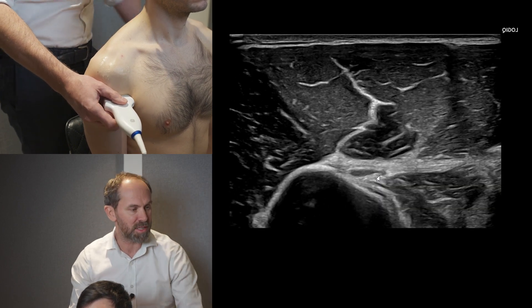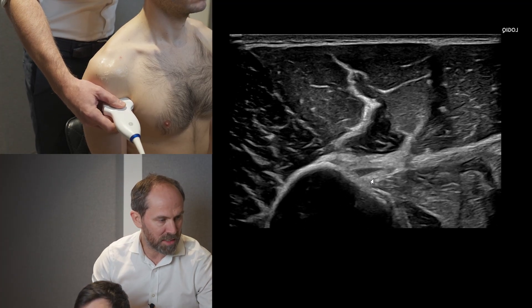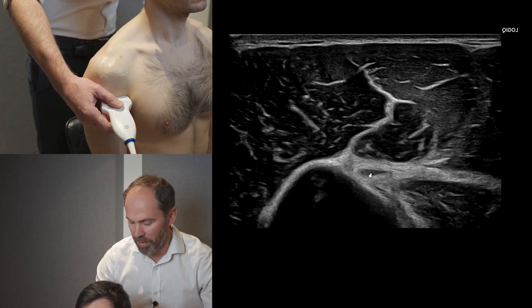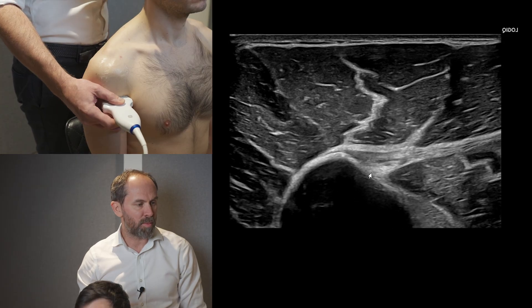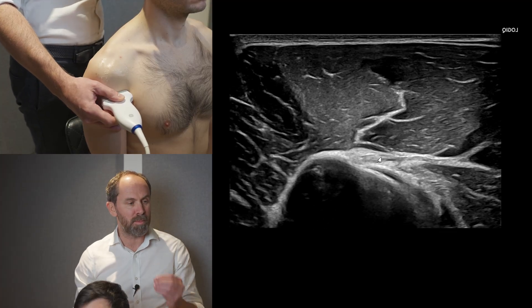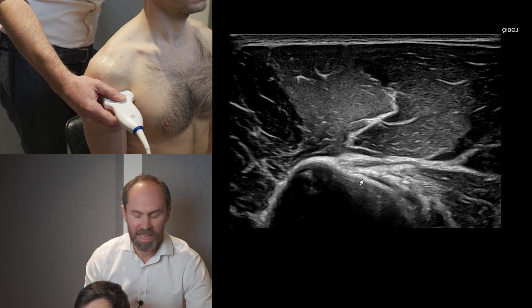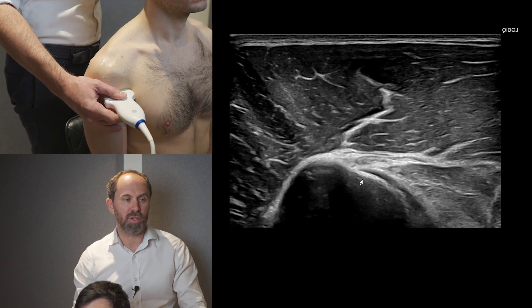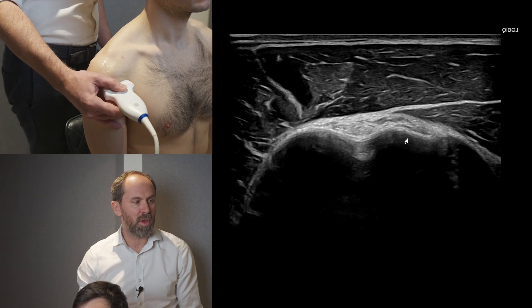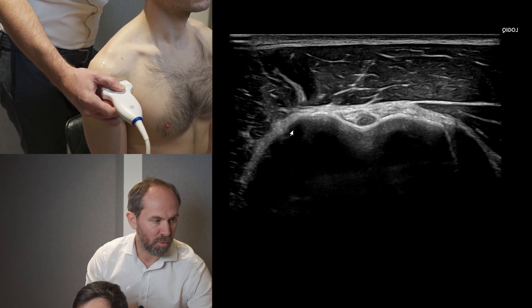You've got your pectoralis major tendon coming across — you can stretch or contract it if you want. Here's the biceps tendon and as we go more distal, the muscle belly comes off. Then we follow the tendon back up. It may go a little dark, so by tilting I can follow it up, always keeping the biceps in the middle of the screen to avoid anisotropy and get a nice clear image. Tilt the probe to keep the bone bright, and make sure the tuberosities remain level.